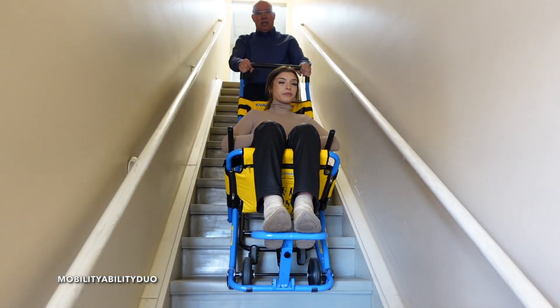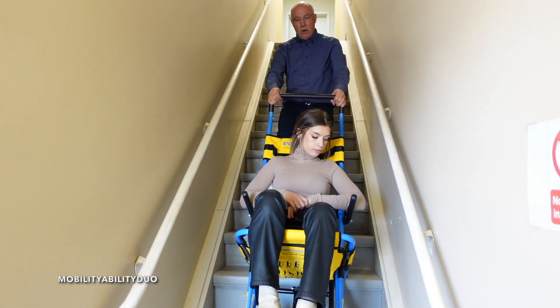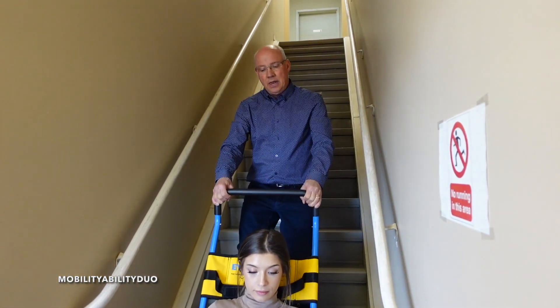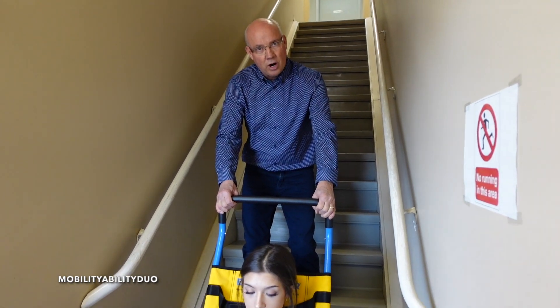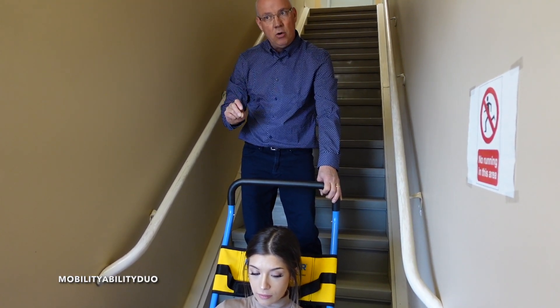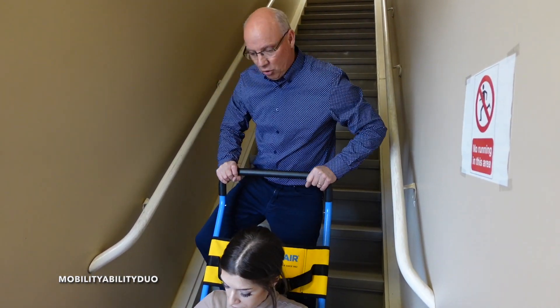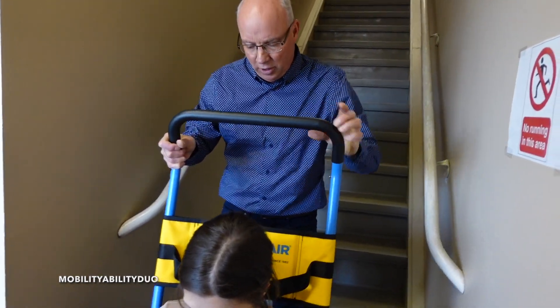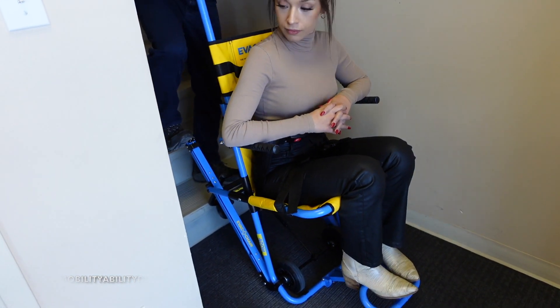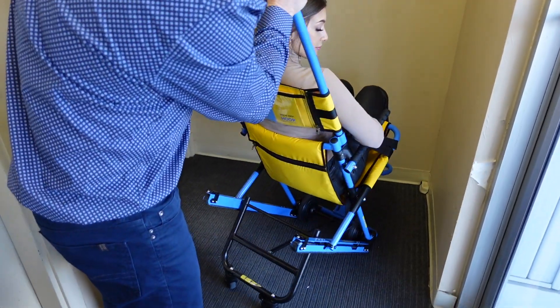So this is pretty easy to use. You just come down the steps, and if there's a fire going on it's a great way to get out. In 9/11, they had one of these on every floor - somebody on the 69th floor was carried out of the building. It saves lives as well. Once you get over here you tip forward and bring this back out, so you can maneuver and turn it. It's almost like four wheels.